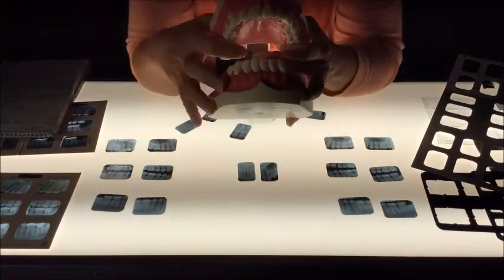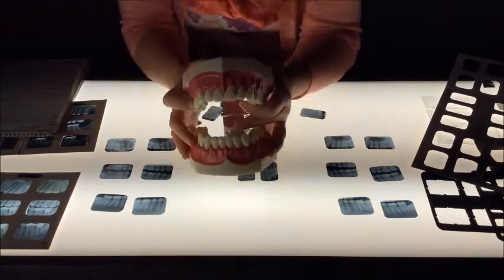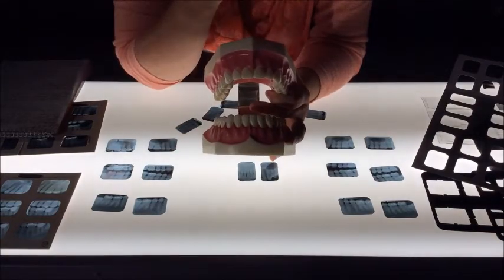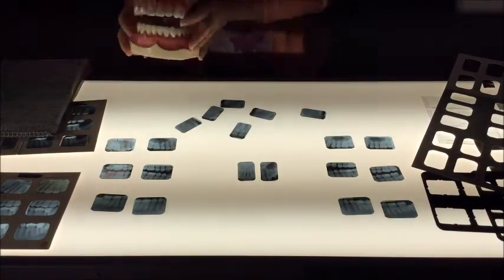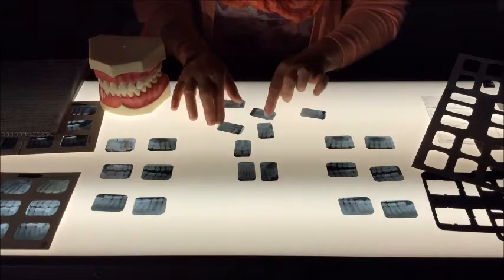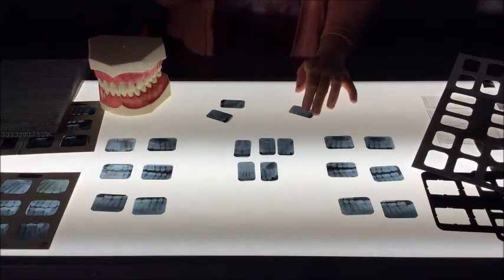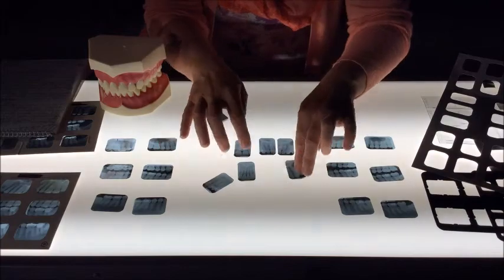Remember, I mentioned to you that the maxilla is hollowed out by maxillary sinuses in the posterior area, but as we come towards the front, we have the nasal cavities. So it will appear like a white lining with a black cloud up above. So we want to look at our films that have a white line with a dark cloud up above the white lined area.